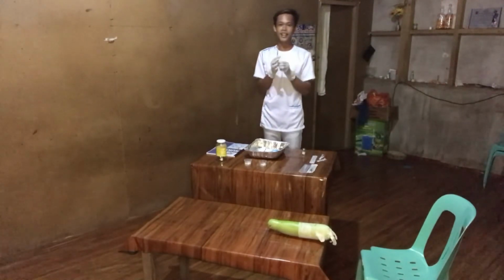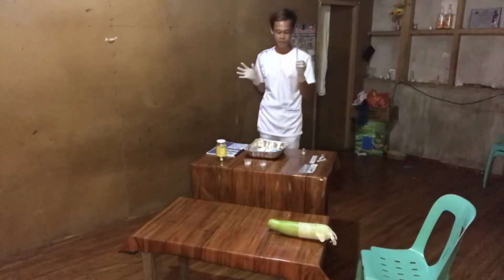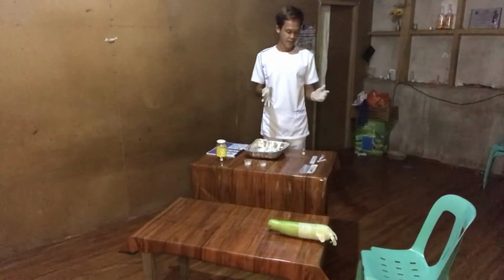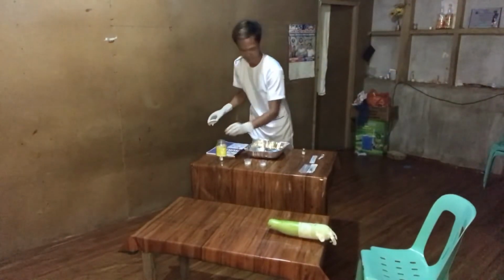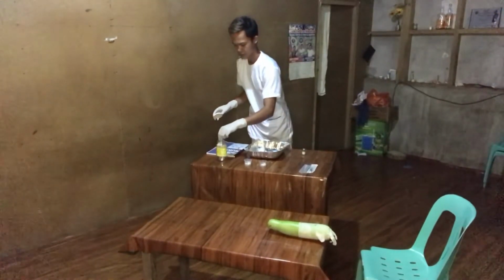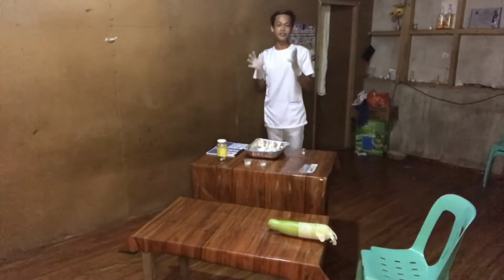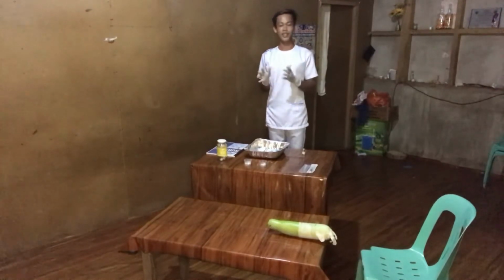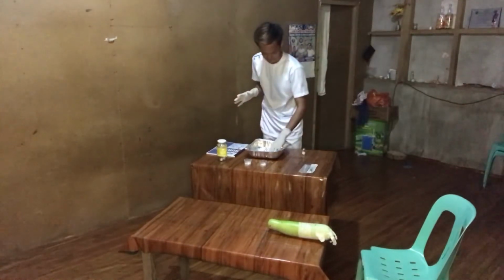Place it in the hypodermic tray and discard the used aspirating needle into the waste receptacle. All of the waste that we have used is placed in the waste receptacle. Next is to write the medication ticket, the name of the drug and the dosage, so that we won't forget what medication we administer.